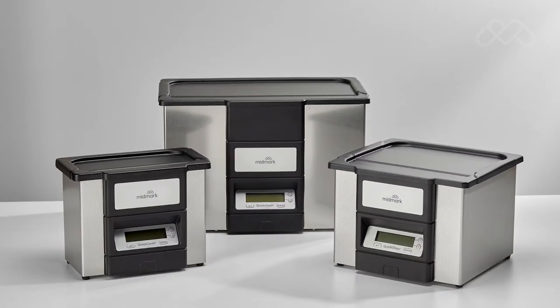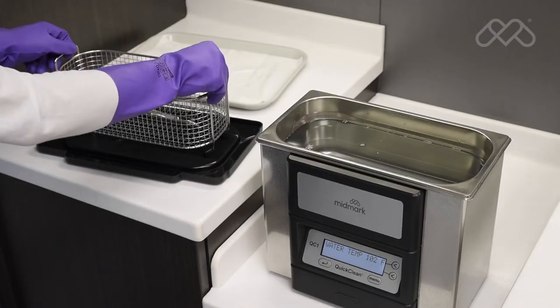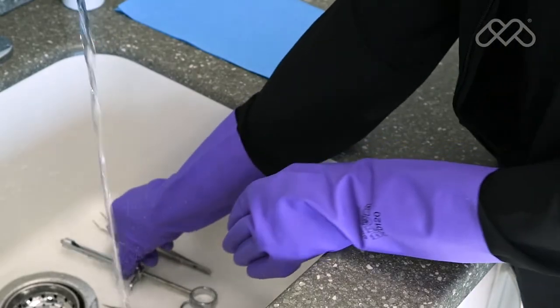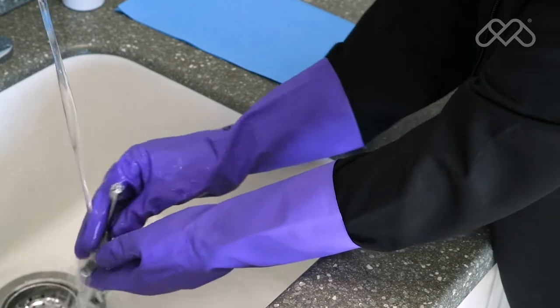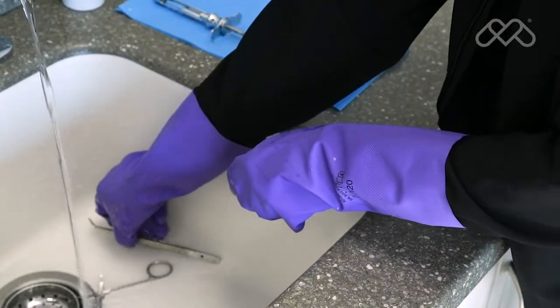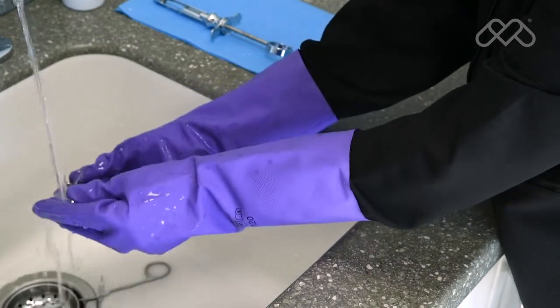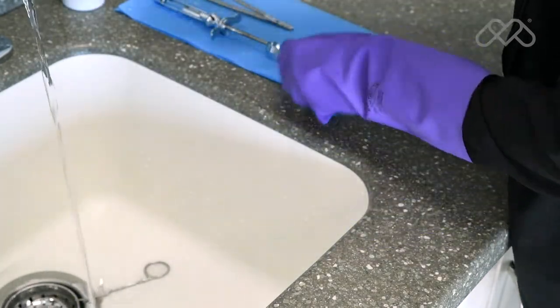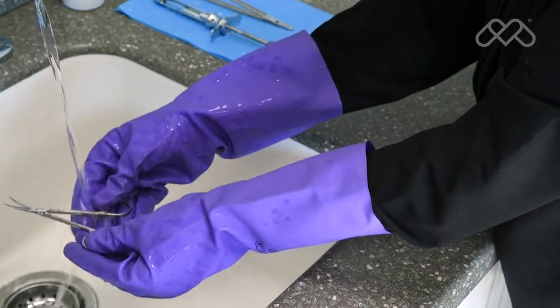The use of automated cleaning equipment, such as an ultrasonic cleaner or washer disinfector, is recommended over manual cleaning for clinician safety and cleaning effectiveness. After cleaning, thoroughly rinse instruments with tap water to remove any loosened debris or residual cleaning fluid. The purity of tap water varies significantly; it is recommended the final rinse be done with water of adequate quality to avoid instrument staining.